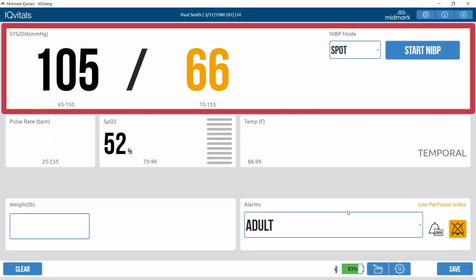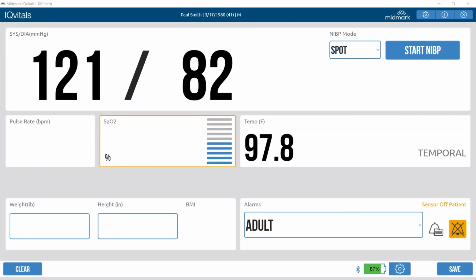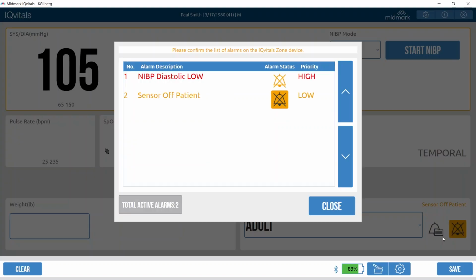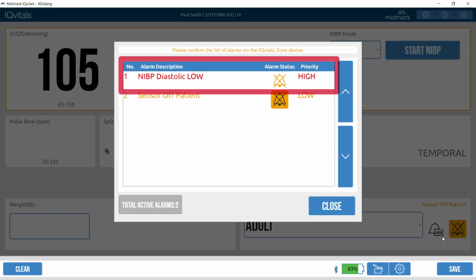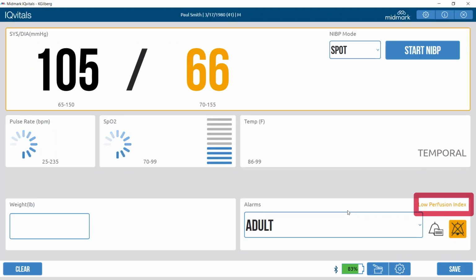If a new alarm state occurs with a corresponding audible alarm, the Alarm Reset button becomes active again. All other visual alarm indicators persist until the alarm state is no longer in effect. If multiple alarm states exist simultaneously, the highest priority alarm will display. Once the high priority alarm is corrected, the device will then display the next alarm to be addressed.